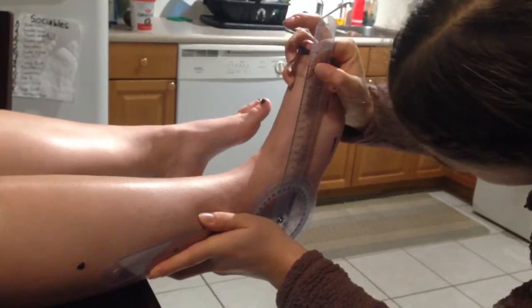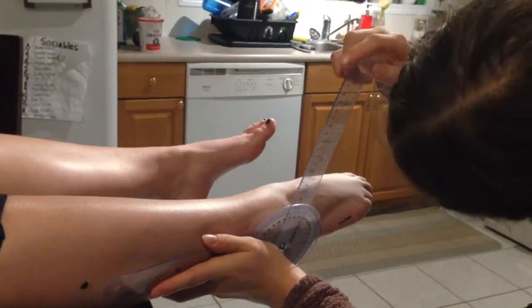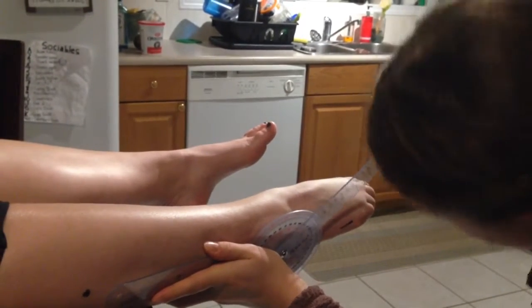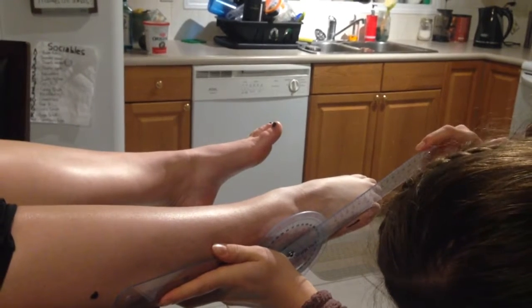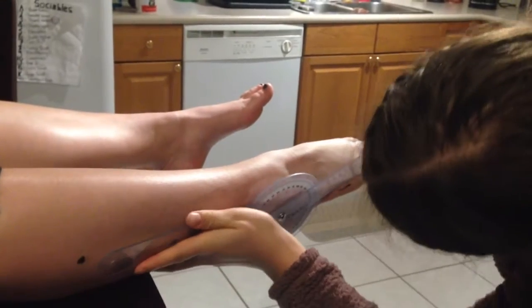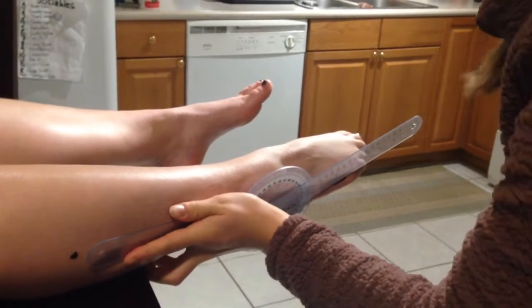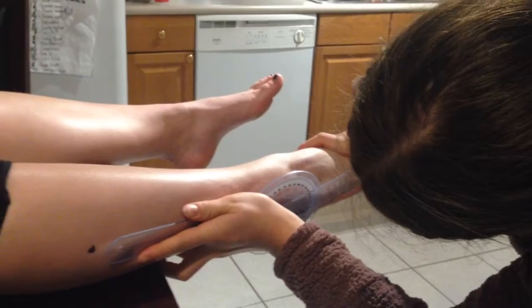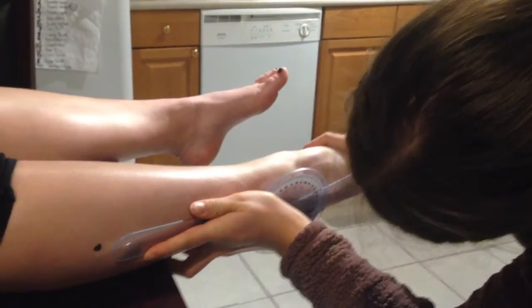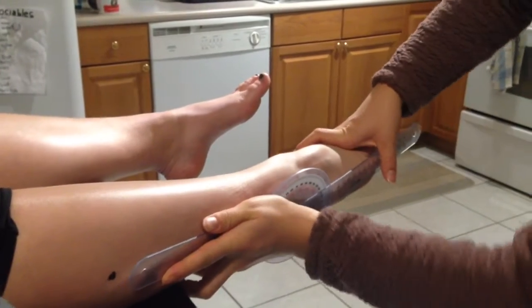I'm gonna go back to 90. Can I get you to point your toes for me? Looks to be about 65. And, gotta make sure my landmarks are still good, is 62. Any pain with that? No. Okay, I'm gonna apply overpressure. And that looks to be about 70 and is 68. Firm tissue stretch and feel. And can I get you to flip over?